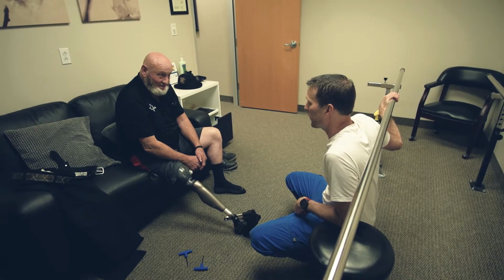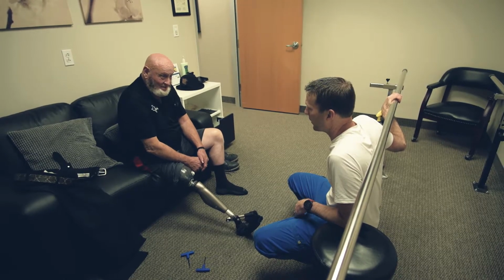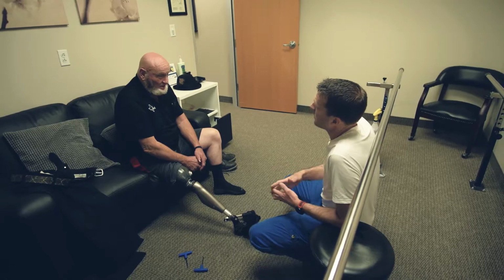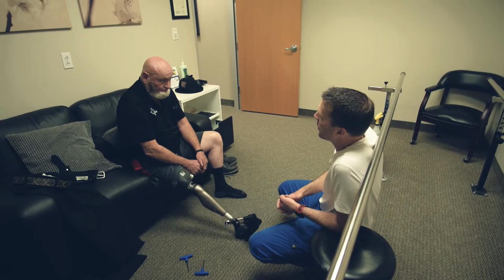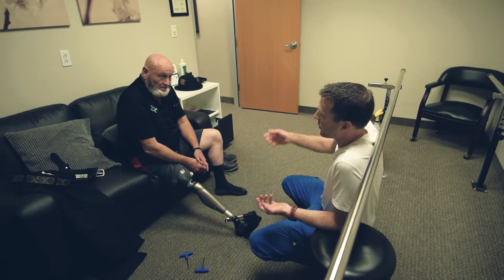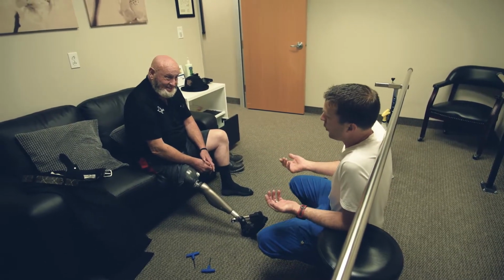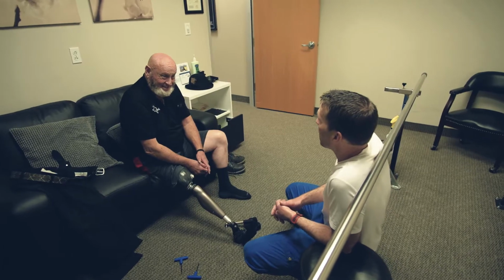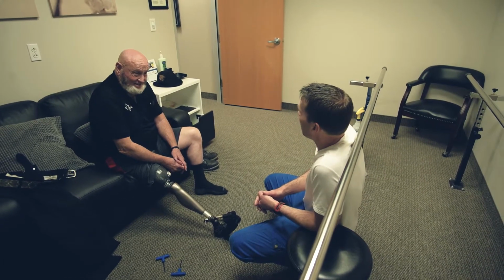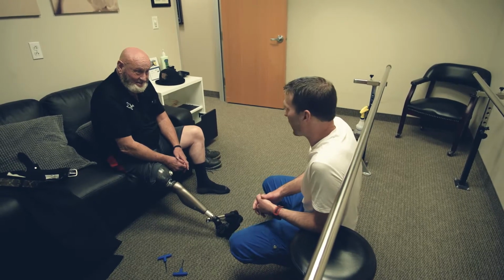The socket is flawed, and it's what we're trying to fix. From the videos I've seen of it, the convenience will just be huge. Plus, you could change weight. Your leg could swell or shrink, and you don't have to worry about the fit. It's cooler. It fits under clothes better. It's far superior, and it's more responsive. So as you move, it's an extension of your femur.